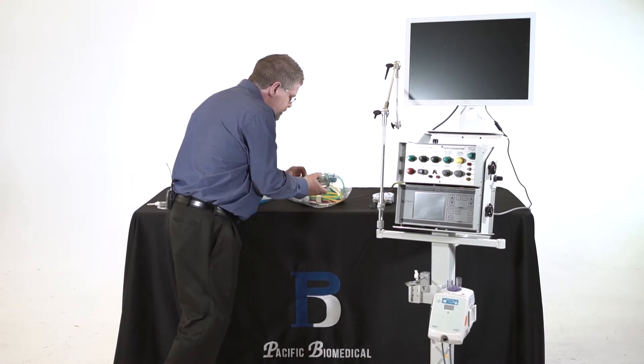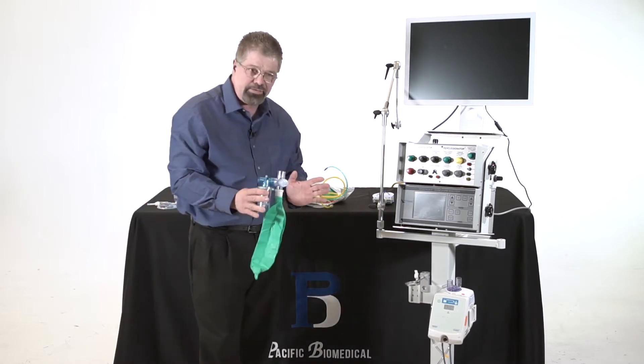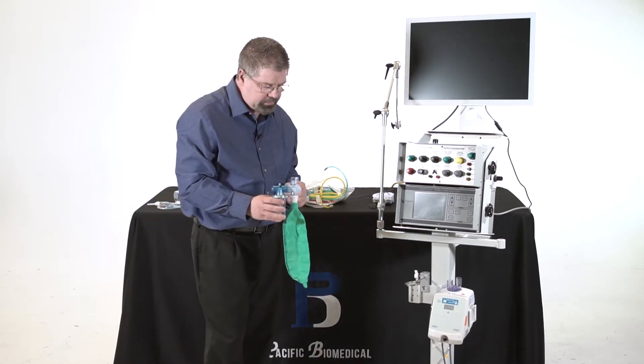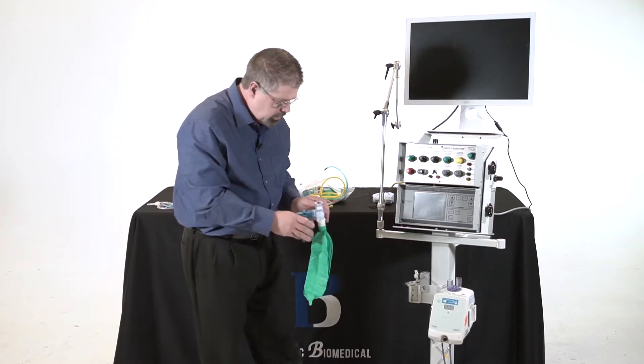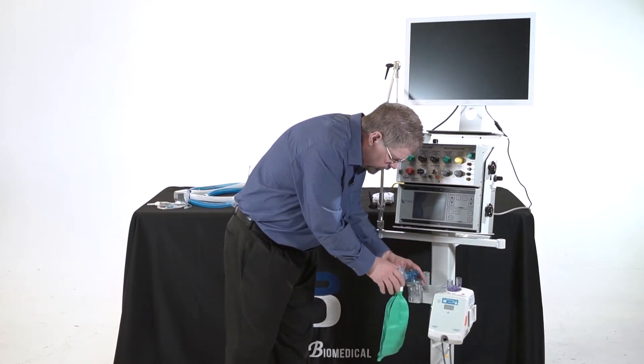So the first thing is the expiratory valve. Now this is a different style of expiratory valve than I've ever seen on a ventilator, but it simply goes right here on this arm.